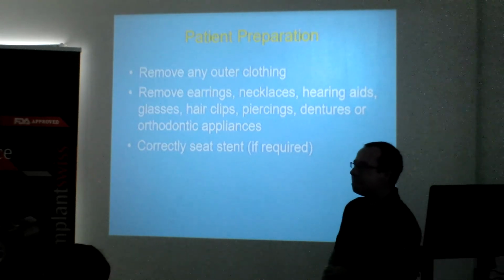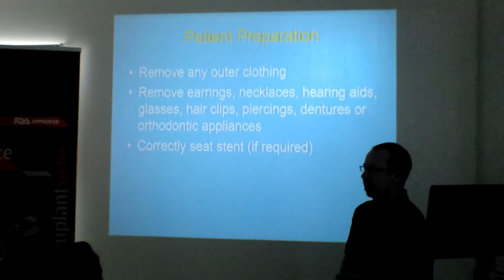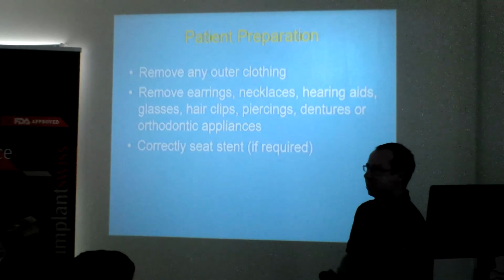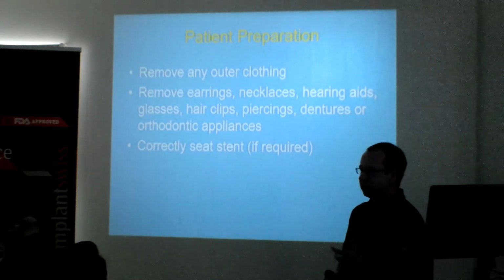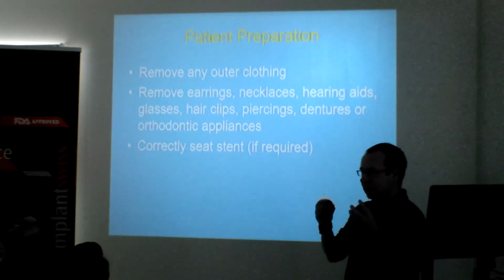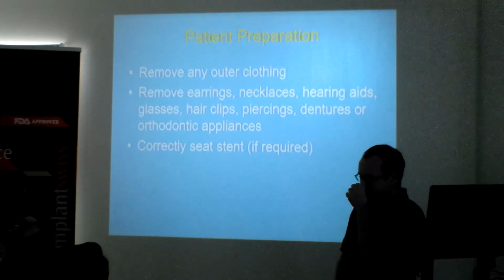Just a quick question. You must have seen quite a lot of different types of stents in your career. What's the simplest, cheapest, and effective stent you will advise? The simplest thing would be an acrylic base with possibly barium sulfate integrated into it. That is really one of the easiest ones. These big chunky ones that stick out of the patient's mouth and have all sorts of wax guides with them are very, very tricky. So they're not easy to use.